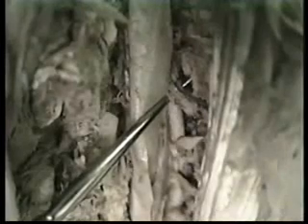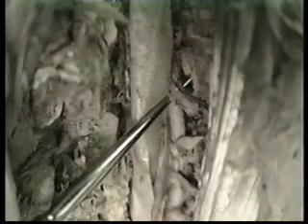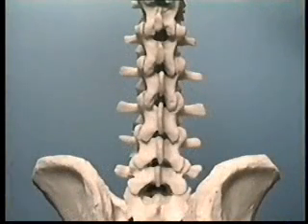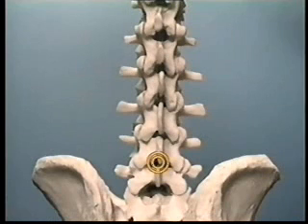Since the needle will be placed caudal to the termination of the spinal cord, there is little danger of paralysis with the lumbar puncture. For a lumbar puncture, the interspace of choice is L4, L5. The spinal cord has terminated by this level, and the interspace height allows easy access to the cistern. Other possibilities for an LP are at L3, L4, and L5, S1.